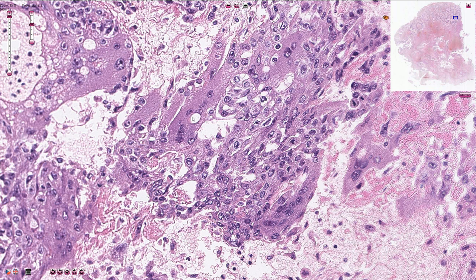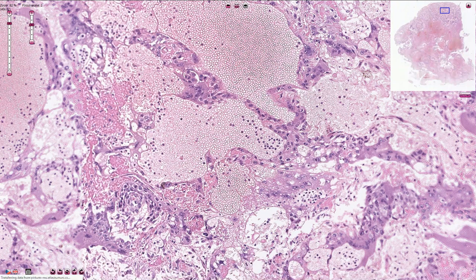Syncytiotrophoblast commonly creates these lace-like structures with fenestrations or bubbles. Quite commonly we also see these blood-filled lakes surrounded by syncytiotrophoblastic cells.